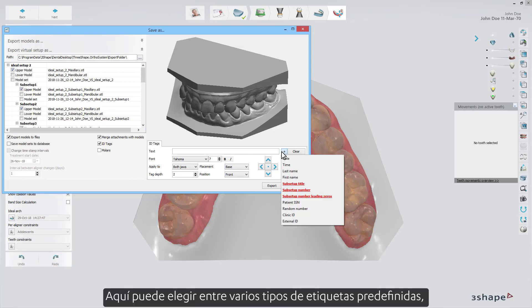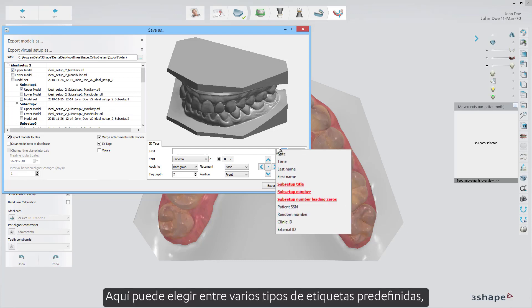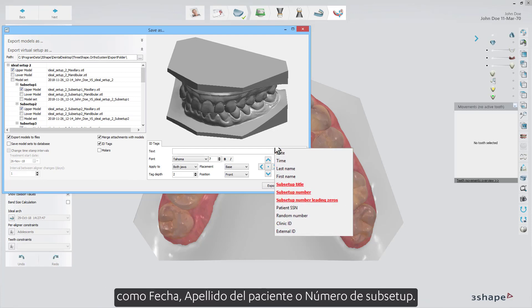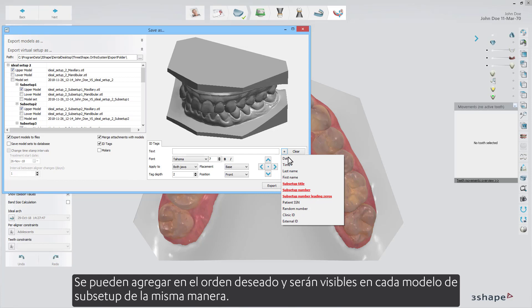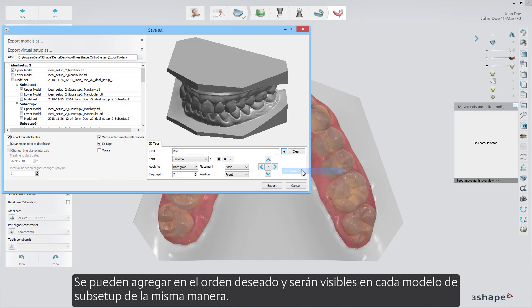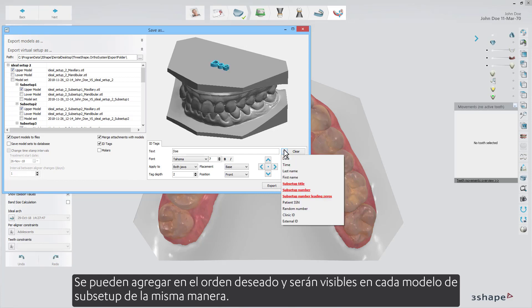Here you are able to choose from various kinds of preset tags, like date, patient's last name, or sub-setup number. Those can be added in the desired order and will be visible on every sub-setup model in the exact same way.